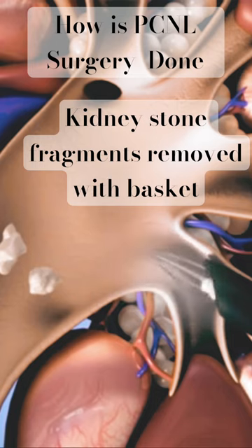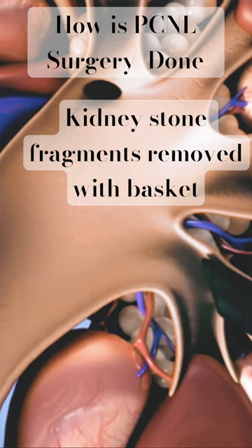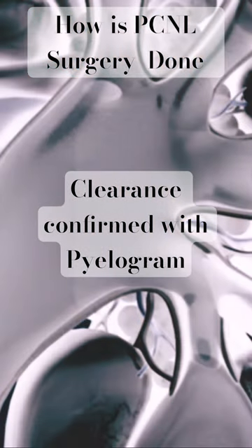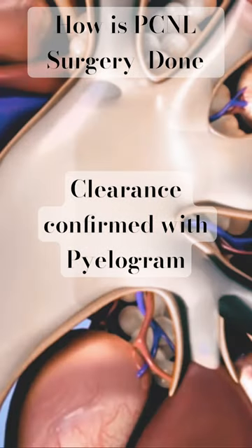After removal of all the stones, your surgeon will perform a contrast study. When there is good passage of contrast material to the bladder, this means that the ureter is also stone free.